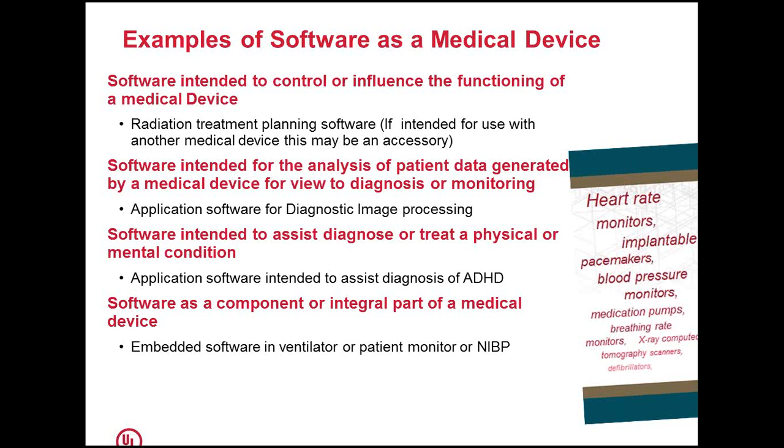A typical example is a picture archiving and communication system, where you take the patient data generated by a device, mostly X-rays, CTs, MRIs, and then offline you view that for diagnosis or monitoring to take for further treatment. Another example, software intended to assist in diagnosing or treating a physical or mental condition.